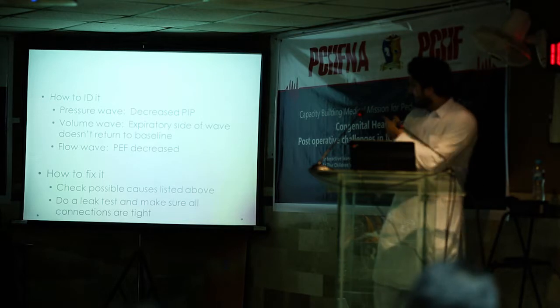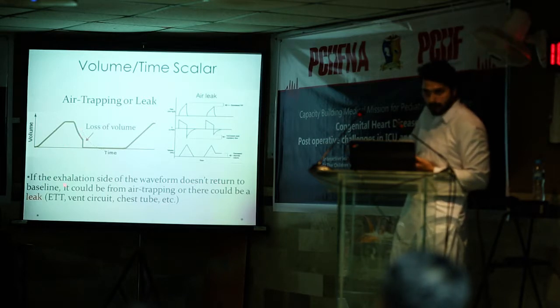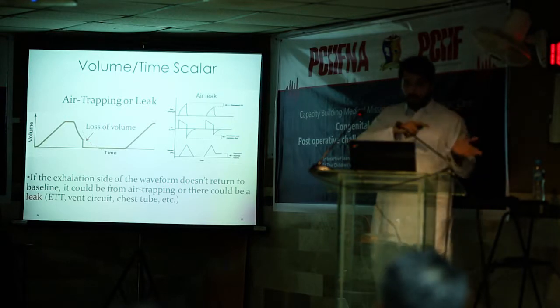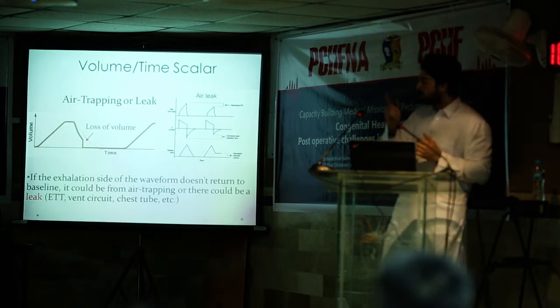So how to identify it? In the volume waveform, it's almost the same as air trapping. It will not come back to the baseline. So if it doesn't come back to the baseline, it could be a leak or air trapping. But how can we say, okay, this is air trapping or this is a leak?